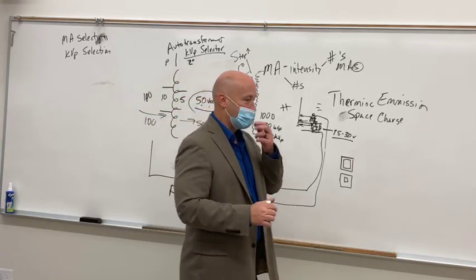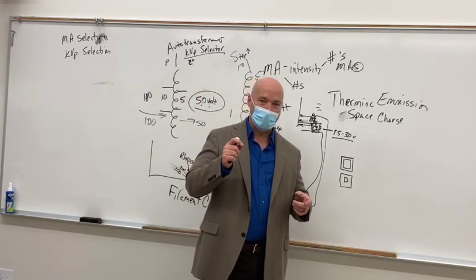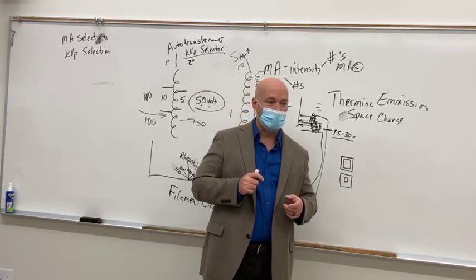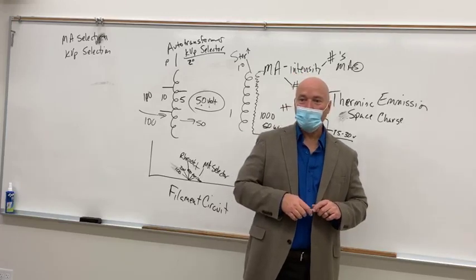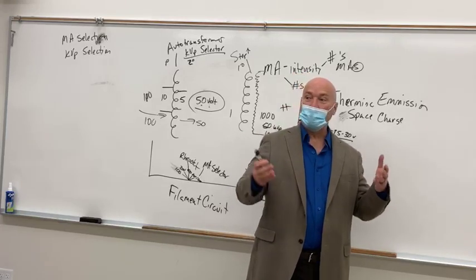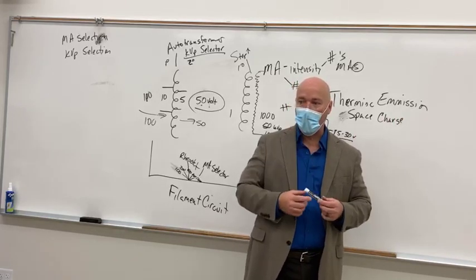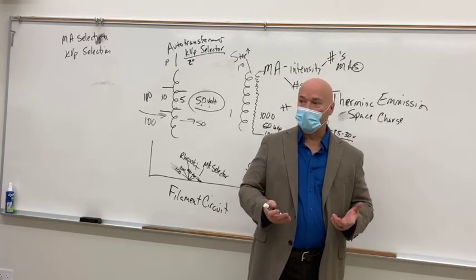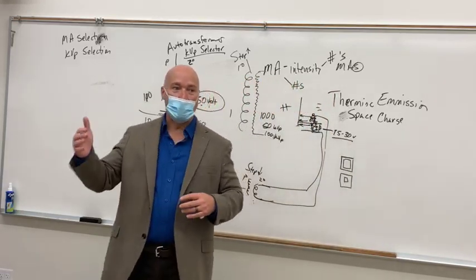Microcalcifications is exactly what it sounds like. So take your pen, pencil, and just as quickly as you can, dot it on the page. Okay, how big is that? Okay, now you put that over that chest x-ray, and how likely would you be to see it? Not very good, right? So in mammo, what we need is extremely high resolution.